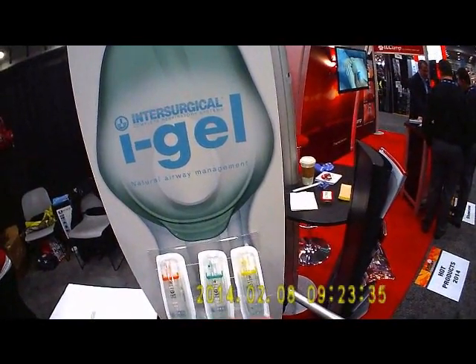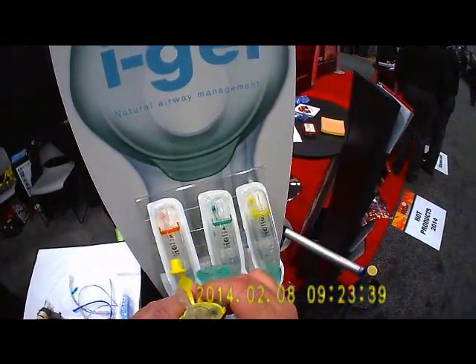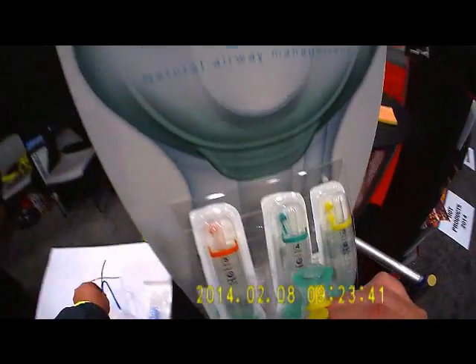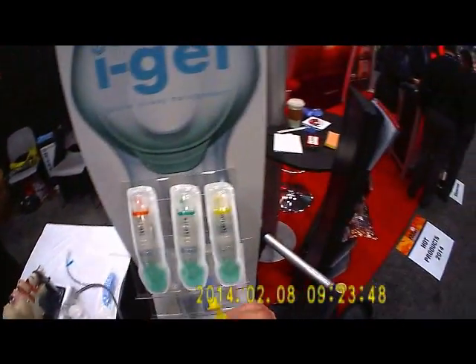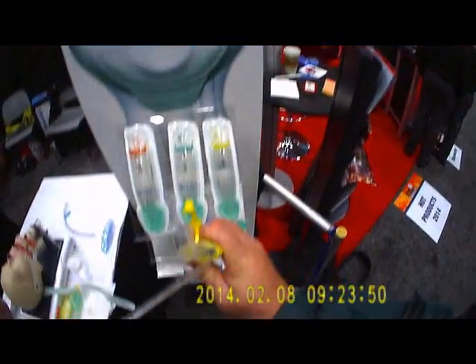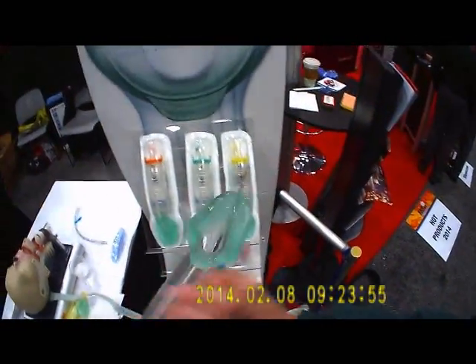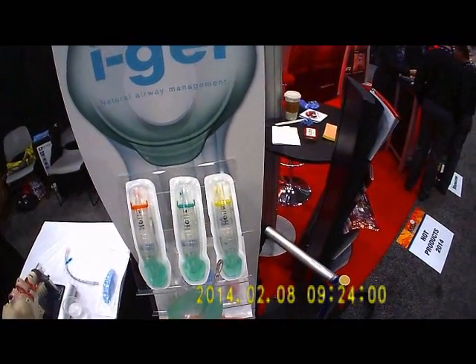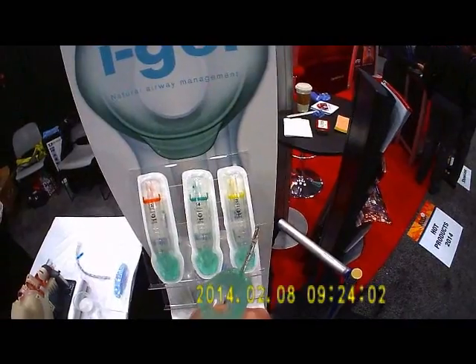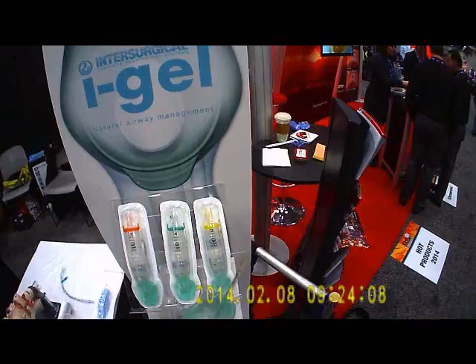The nice thing about the new iGel is that it incorporates a suction port. You can do gastric decompression and suctioning through the device. We'll feed our catheter through here, and as you can see, it passes out the distal tip of the device. You can suction and provide some gastric decompression if there was gastric extension and insufflation before you arrived on scene.